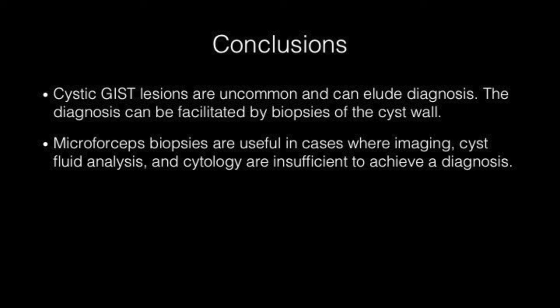In conclusion, cystic GIST lesions are uncommon and can elude diagnosis. The diagnosis can be facilitated by biopsies of the cyst wall to allow for analysis with histology and immunohistochemistry. Microforceps biopsies are useful in cases where imaging, cyst fluid analysis, and cytology are insufficient to achieve a diagnosis.